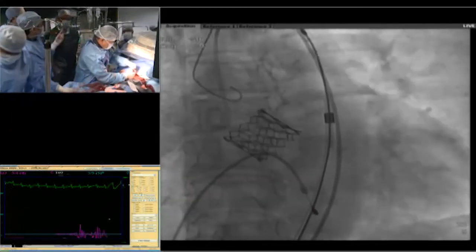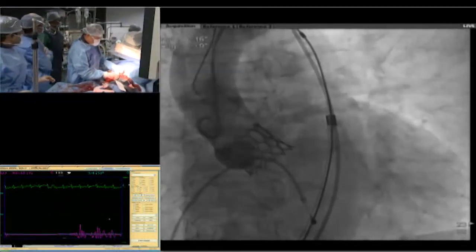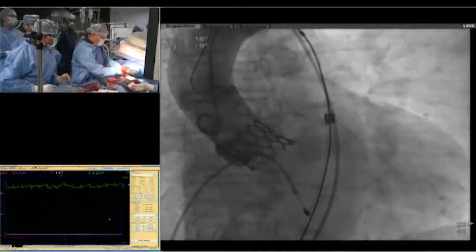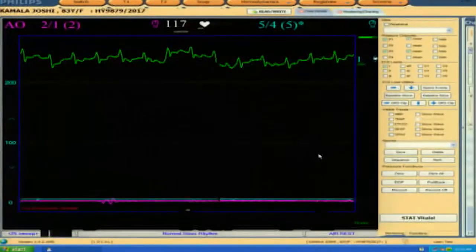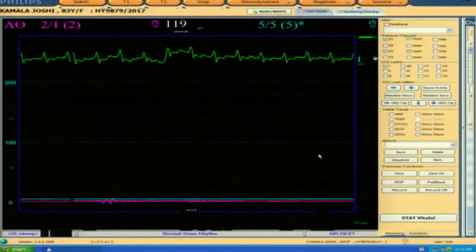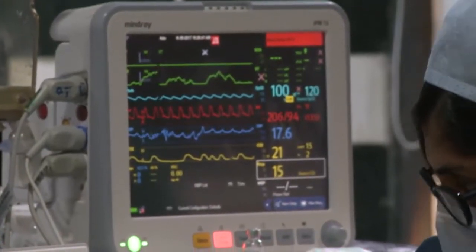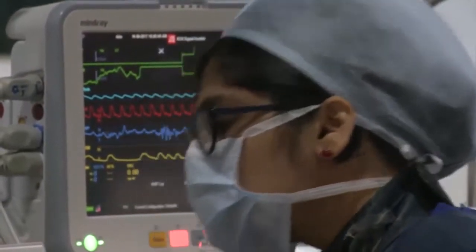Show us the blood pressure, please. Can somebody focus on the blood pressure? Camera, show us the hemodynamics on the screen. No, we can't do anything about it. Just hold some pressure. We need to just press and get the vascular surgeon to do it maybe. We'll go from the other side, maybe occlude for some time. Because what happened? We lost the wire. The wire won't come out from this. Oh, that's a problem. So what we'll do is just show us the hemodynamics. Don't worry.